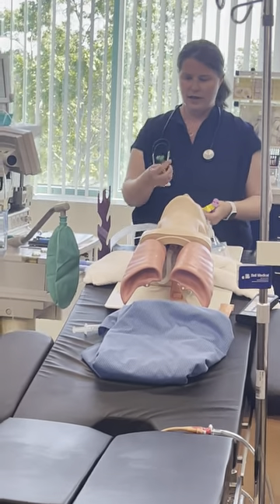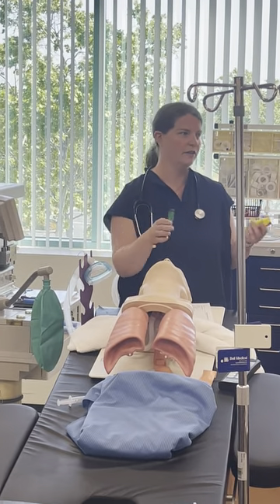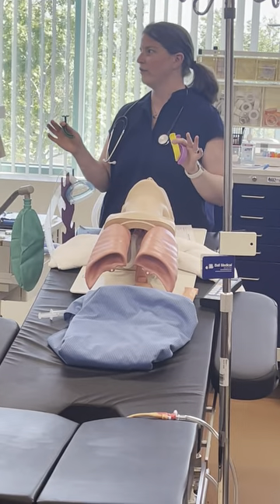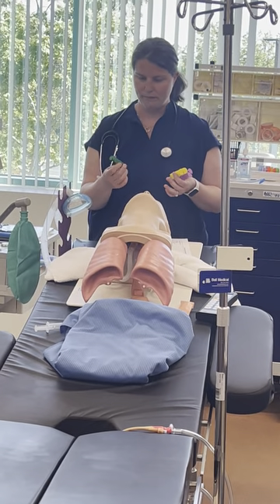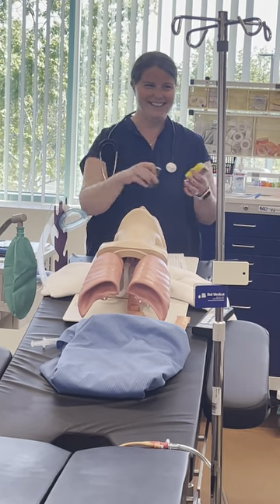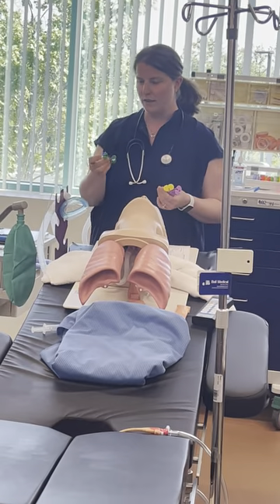So then — more equipment — these are our OPAs. This brand happens to be color-coded; others just have numbers on them. Sizes vary very widely by manufacturer, and some aren't even labeled except on the bag that you open them from.